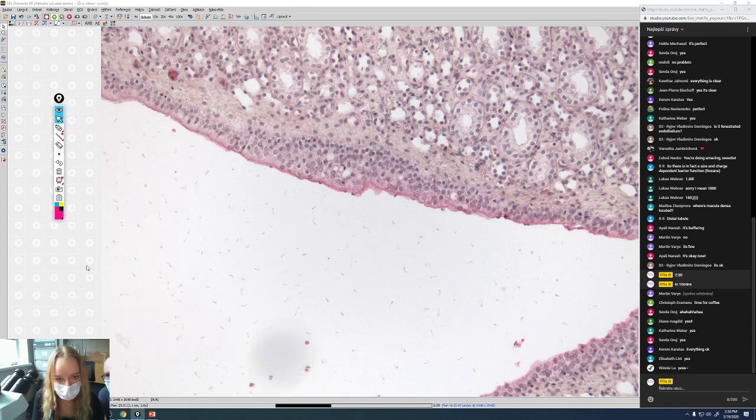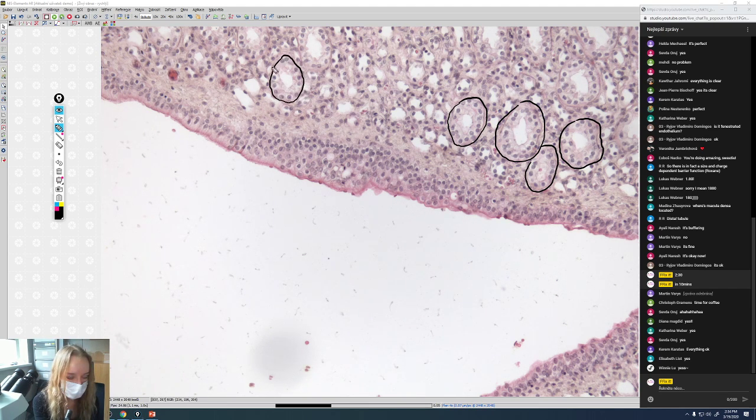And we can see here near the calyx big collecting ducts, which can be called papillary ducts, or ducts of Bellini, which are lined with high columnar, simple columnar epithelium. So big collecting ducts here, tubules, and also here is one big duct of Bellini.